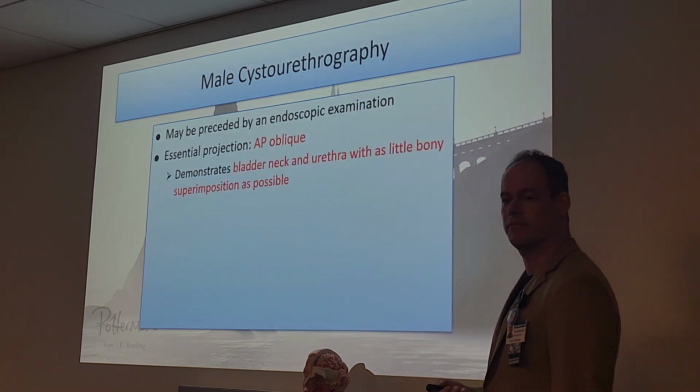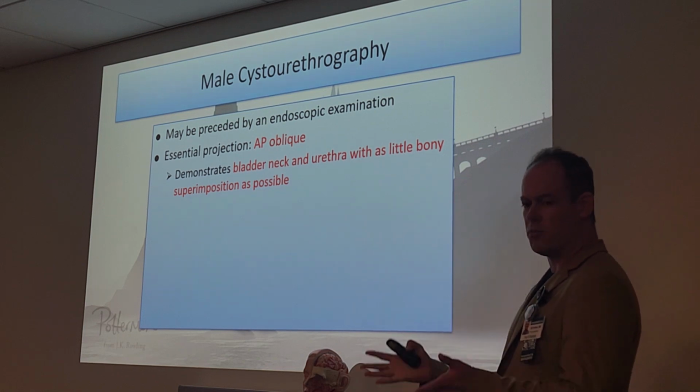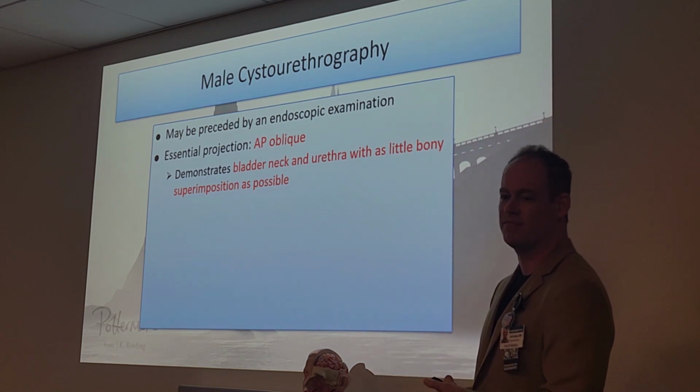So if you place it on the thigh, it's already in the oblique position, sir? Well, you need to oblique the patient. You just want to make sure the urethra is on the thigh. So you might have to help the patient out there if they can't do it themselves.